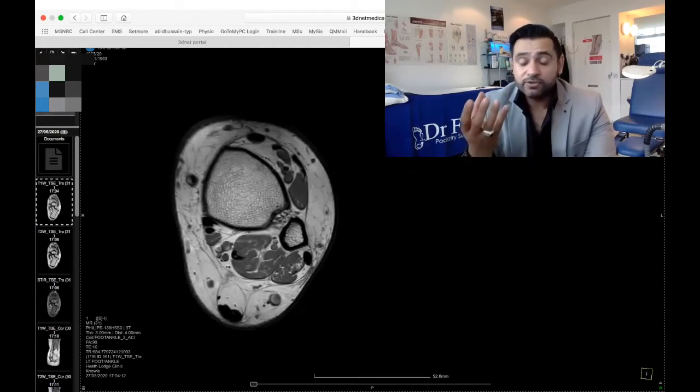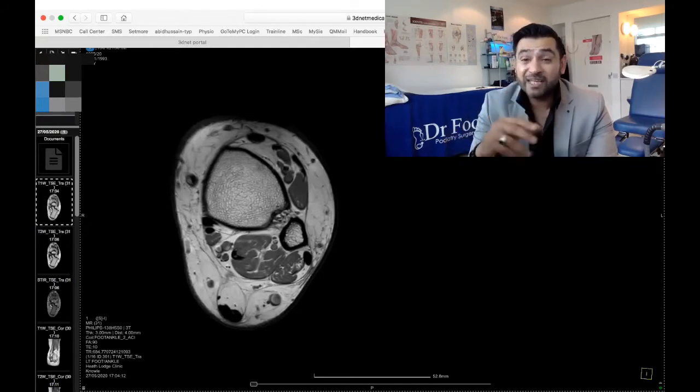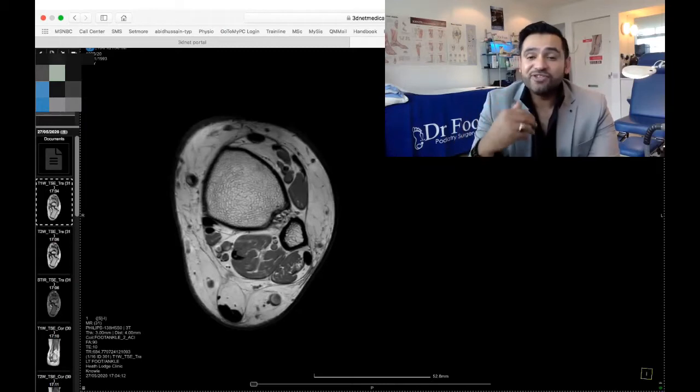That's very important. Number two, I send quite a few patients off for MRIs because that's the kind of cohort I'm seeing. I'm seeing a lot of athletes, professional and recreational. So I get to view them quite a lot. And it takes about 10 to 15 days for the radiographer's report, but I get the images straight away, which is why I have a lot of practice trying to guess the diagnosis, and that's how I've learned.